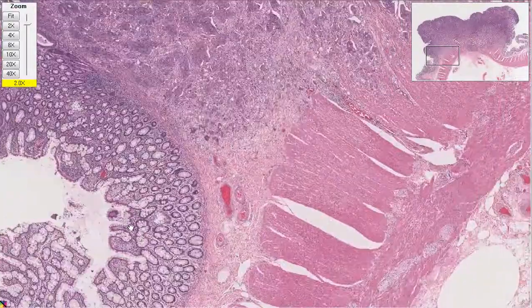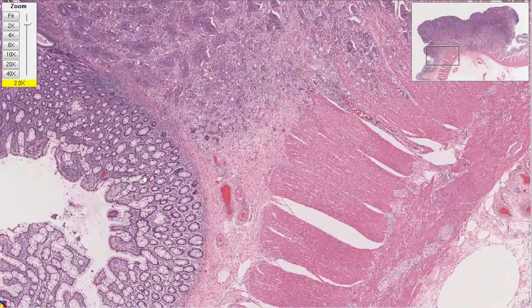So once again, we find normal. And so this is even not perfectly normal. You can see it's a little bit dividing and a little bit irritated. So this is irritated along the edge. Hyperplasia. Exactly. I'm learning something.